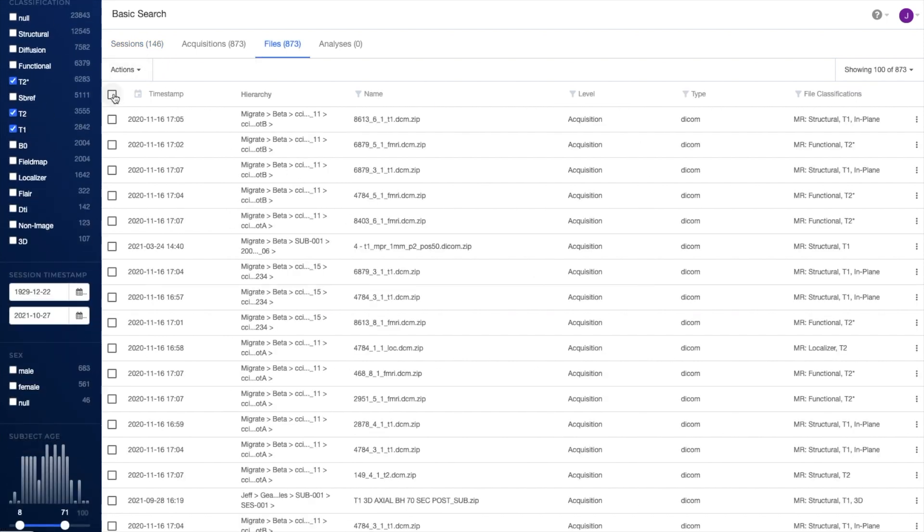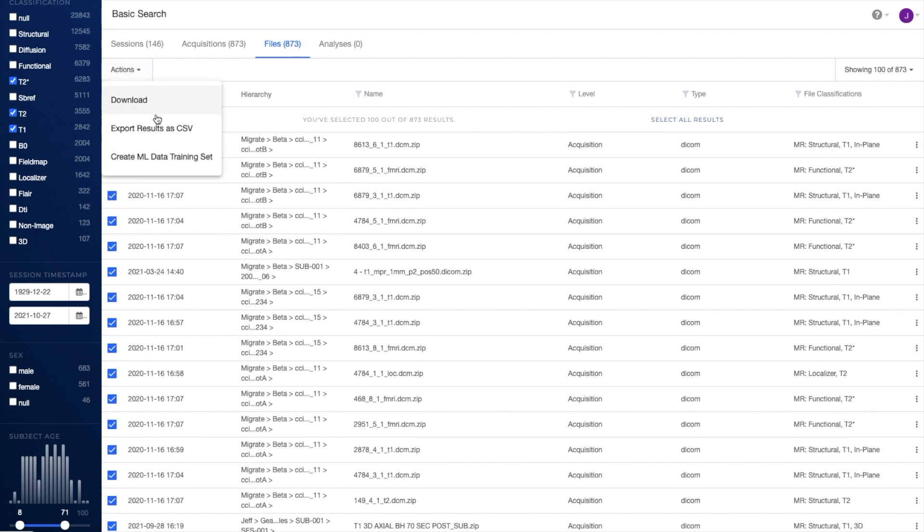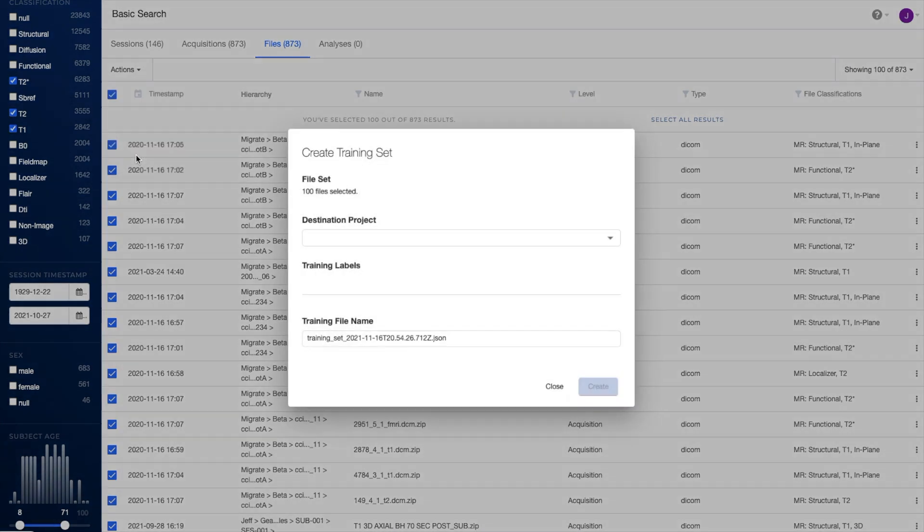From the Search Console, you can easily manage your data, either export results for use offline, batch run analyses, or create machine learning datasets.